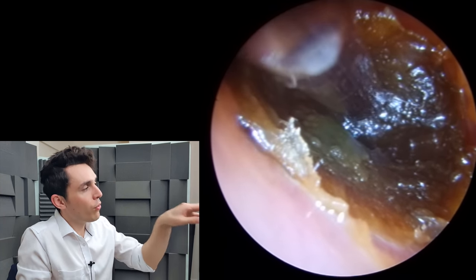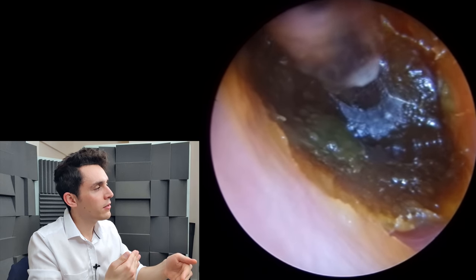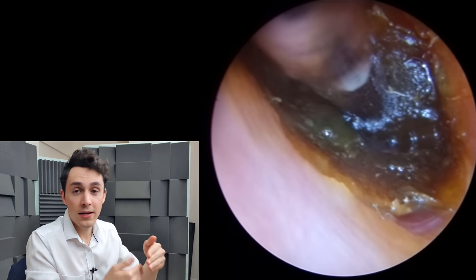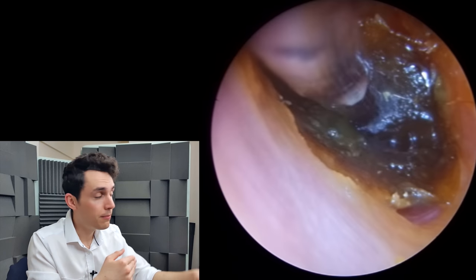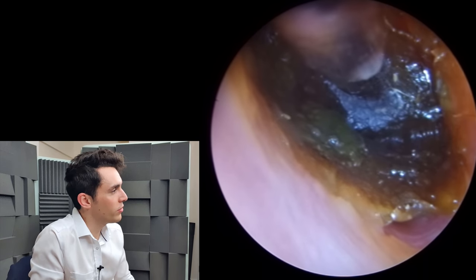At this point in the procedure I didn't know how thick the plug of debris was. So I didn't know if the eardrum was a tenth of a millimeter behind the plug, or if I had a couple of millimeters of buffer room between the plug and the eardrum. So in that sense, I was a little hesitant to jostle it around and be a bit rougher with it.